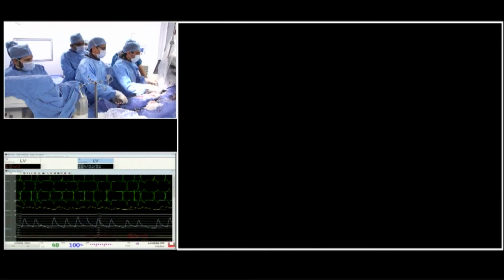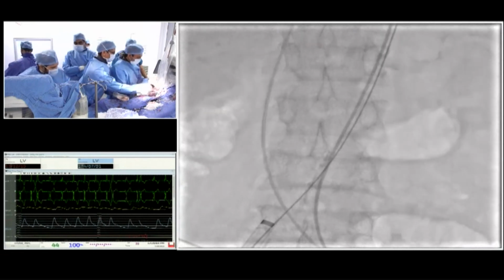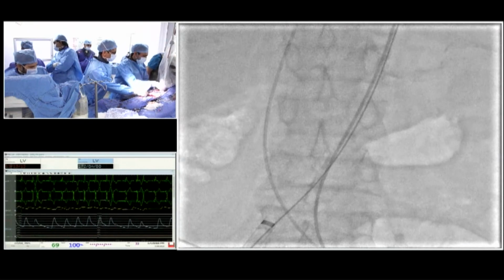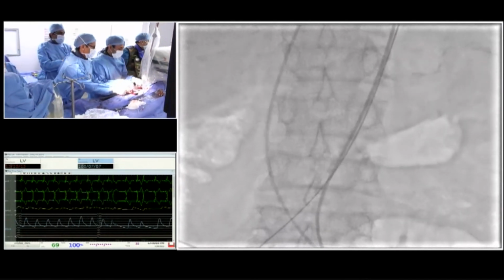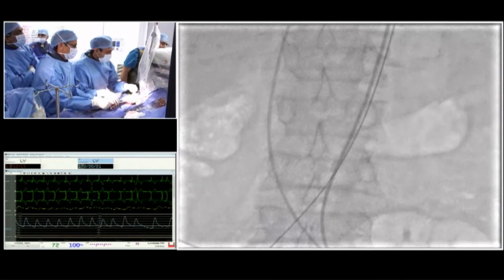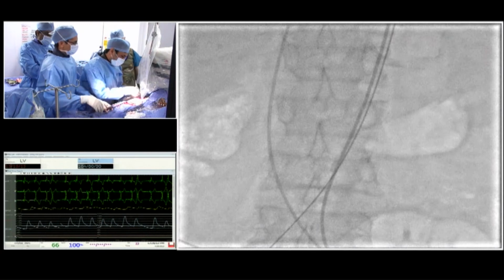By the time they are cleaning it, Ravinder, it is not done faster than angioplasty, but it was done in a record time. Angioplasty can be done in 3 or 4 minutes. We will not accept that statement. But CTOs, you don't take 2 hours. We don't want to do it fast, we want to do it safe. Actually, we can see that your skill level is excellent, no doubt about it. And it is very well demonstrated.